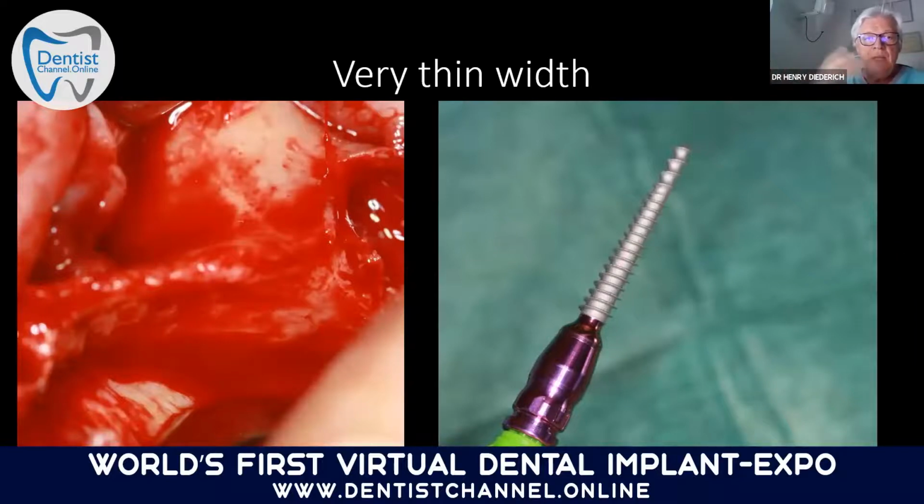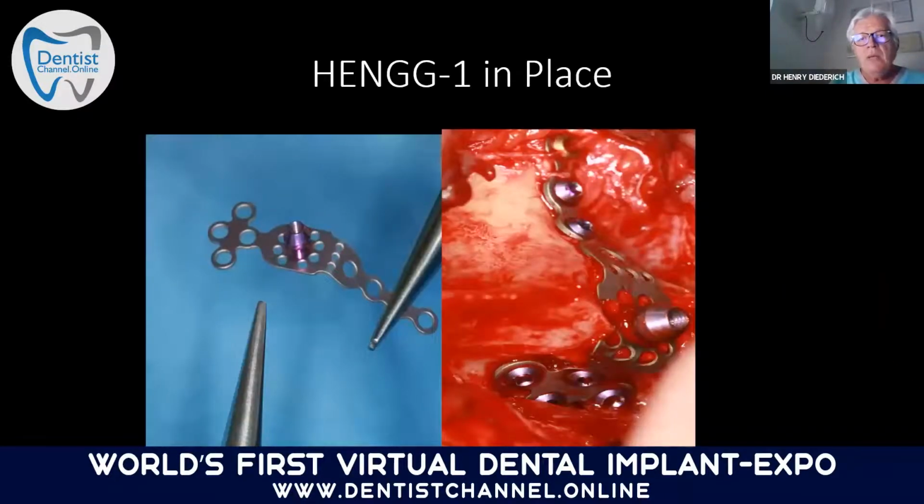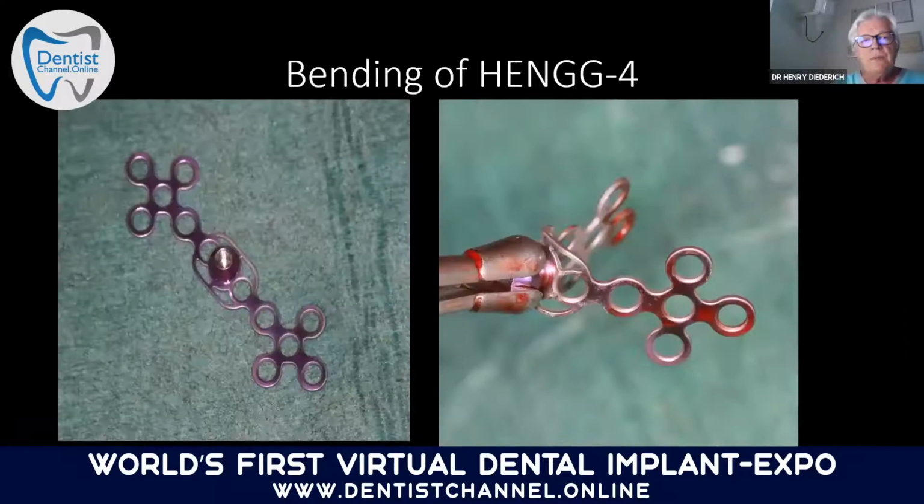And always the treatment concept is the same. We are beginning with the pterygoid implants. And you see here the pterygoid implant is in place. We are adapting our plate. And the HENGG-1 here, you see it is fixed. See the cortical anchorage on your zygomatic bone. And then in the palate, a maximum strong fixation with 4 screws.